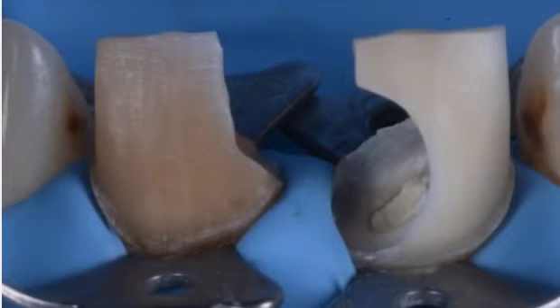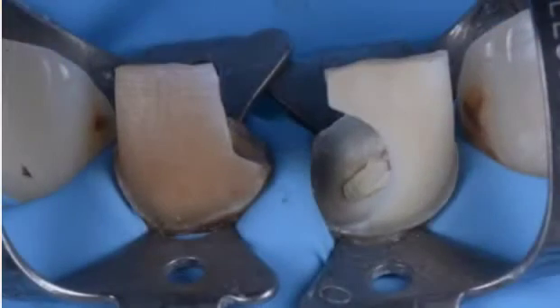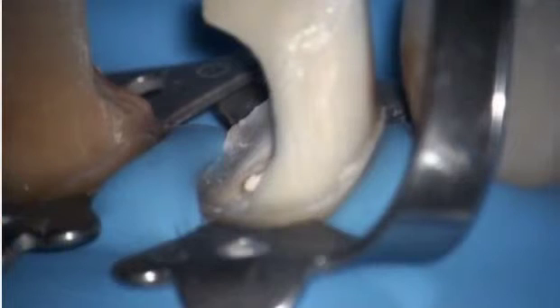I place my clamps on, these are 2.0 clamps by KSK. And now, to help me to secure the margin, especially in the mesial part of this incisor, we will use the Teflon tape, and now we can see it on a video.